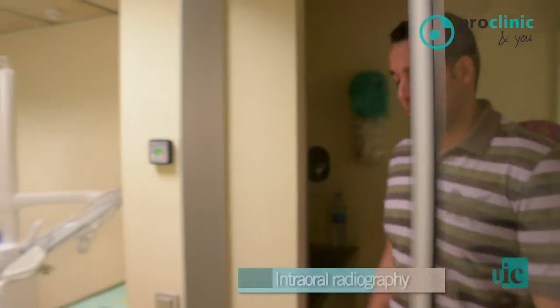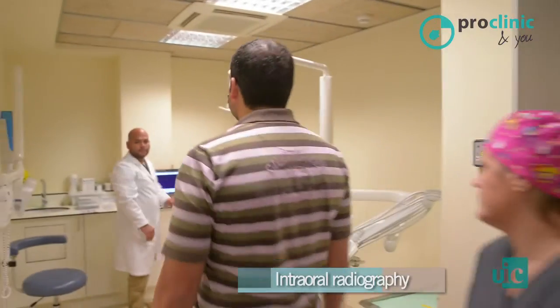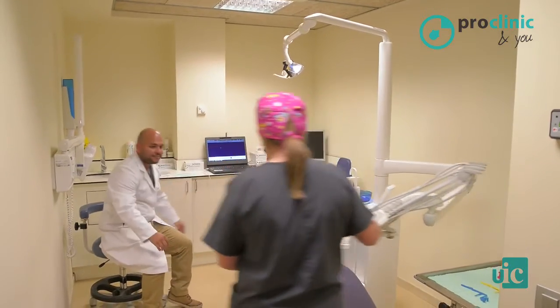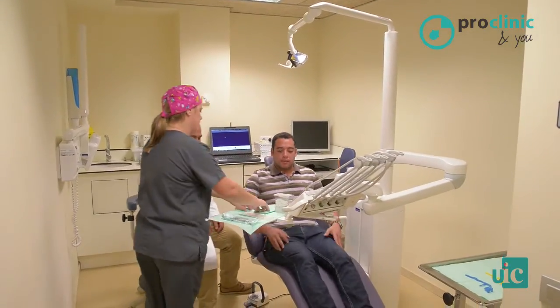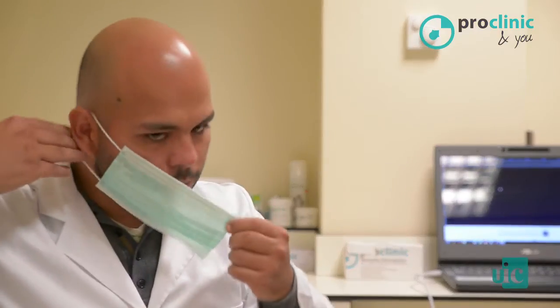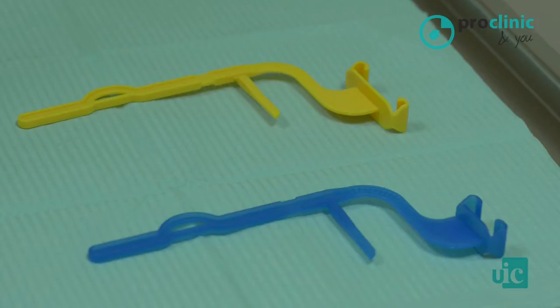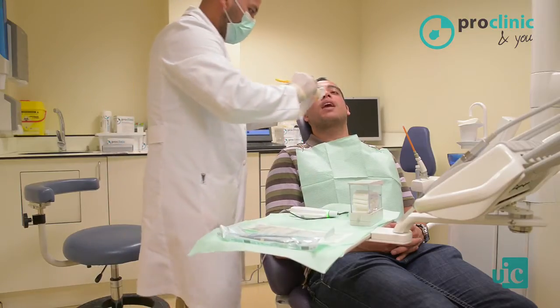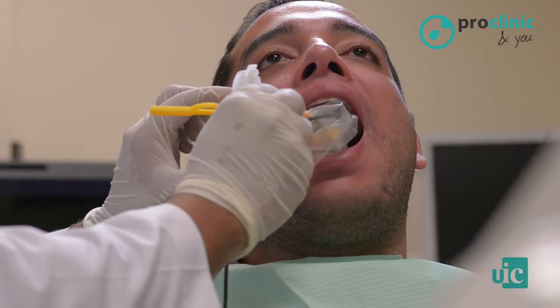There are basically three types of intraoral radiography: periapical radiography, occlusal radiography, and bite-wing radiography. Periapical X-rays are perhaps the most used or most common in dentistry because they allow us to see any kind of dental pathology and also allow us to track different clinical procedures such as root canal treatment or fillings.